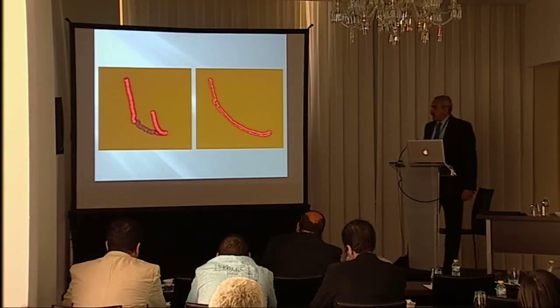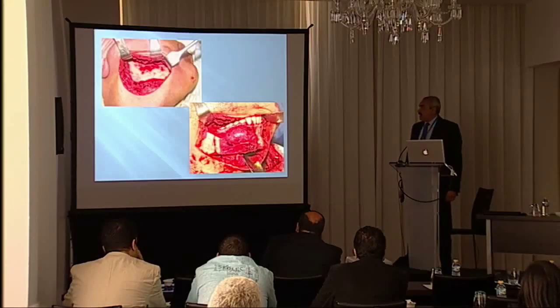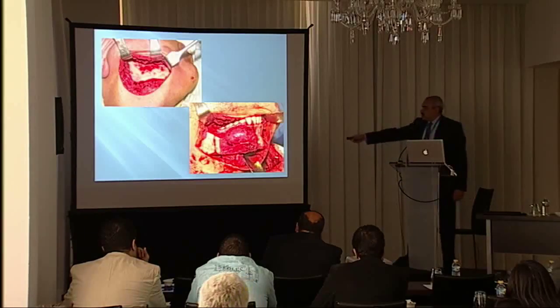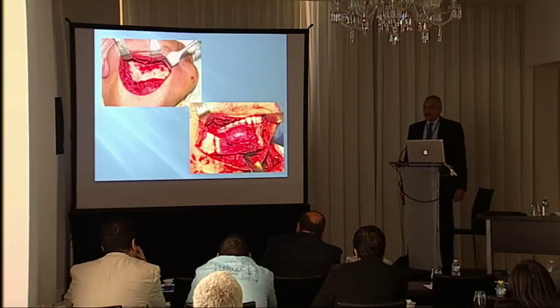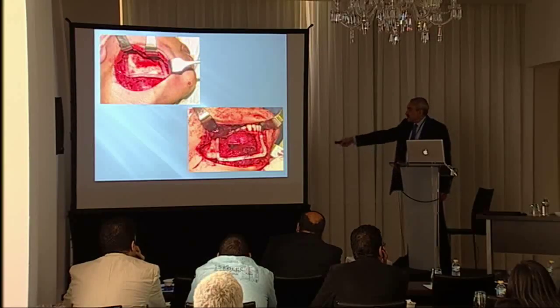We're still studying that. This is the resection template, and this is the reconstruction plate template, and that is the surgical case. We do here a submandibular incision, and this is a subperiosteal dissection plane. When the lesion is perforating the cortex somewhere, we do a supraperiosteal dissection plane and leave the periosteum on top. Then we place the resection template, and it fits perfectly well.